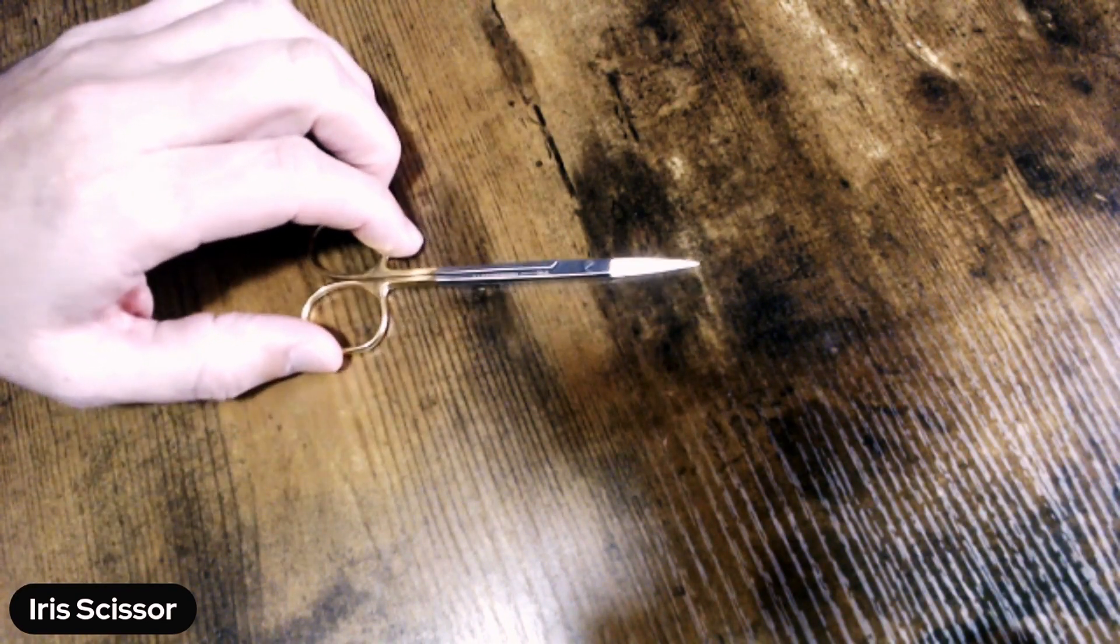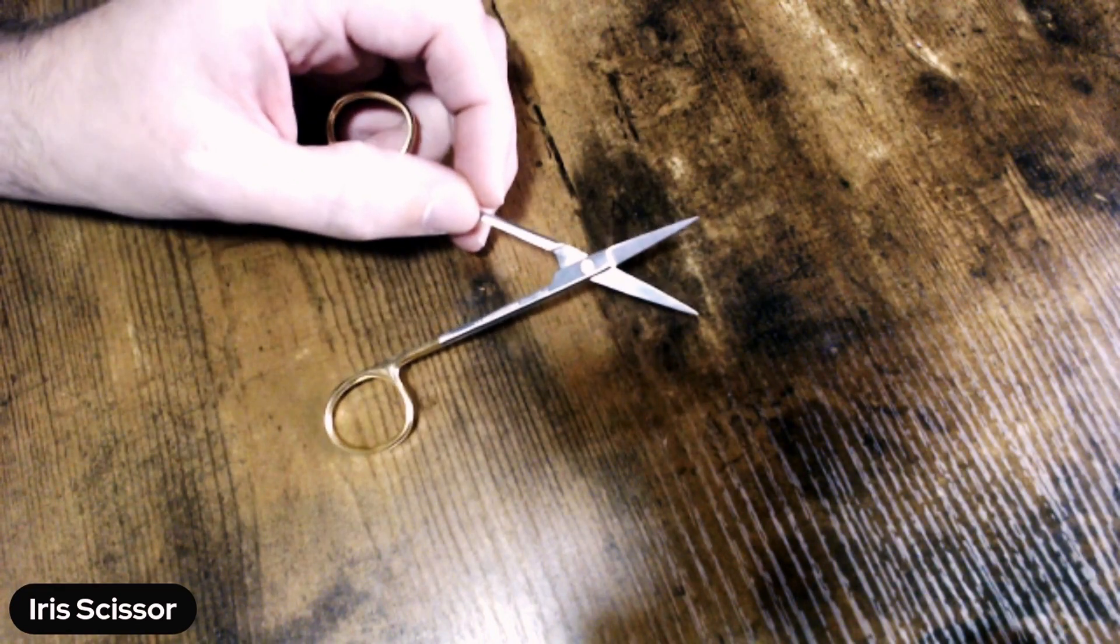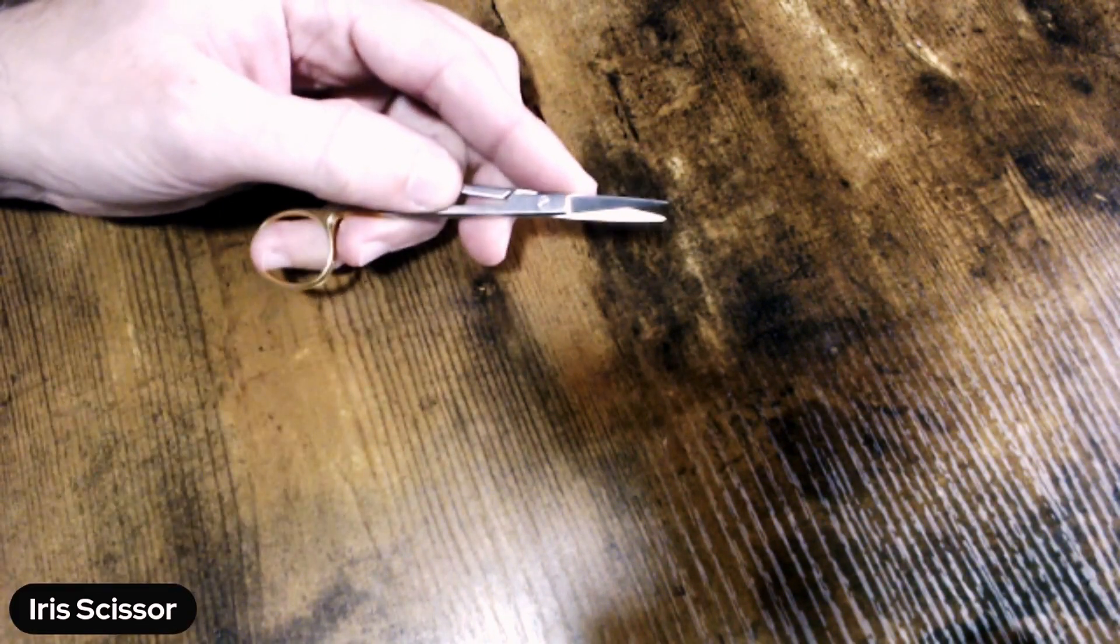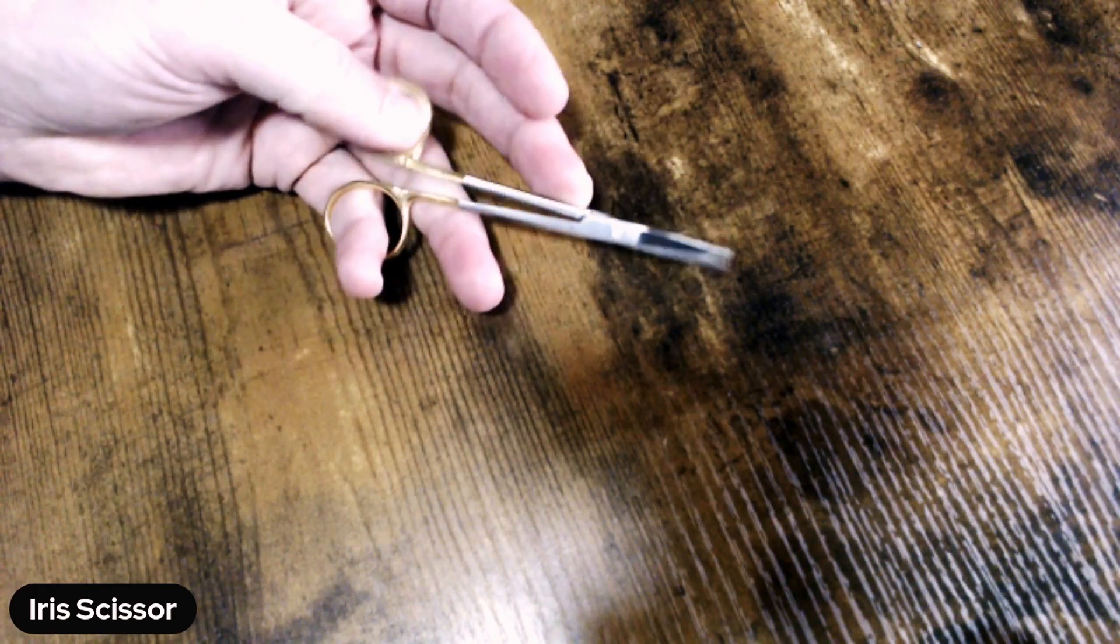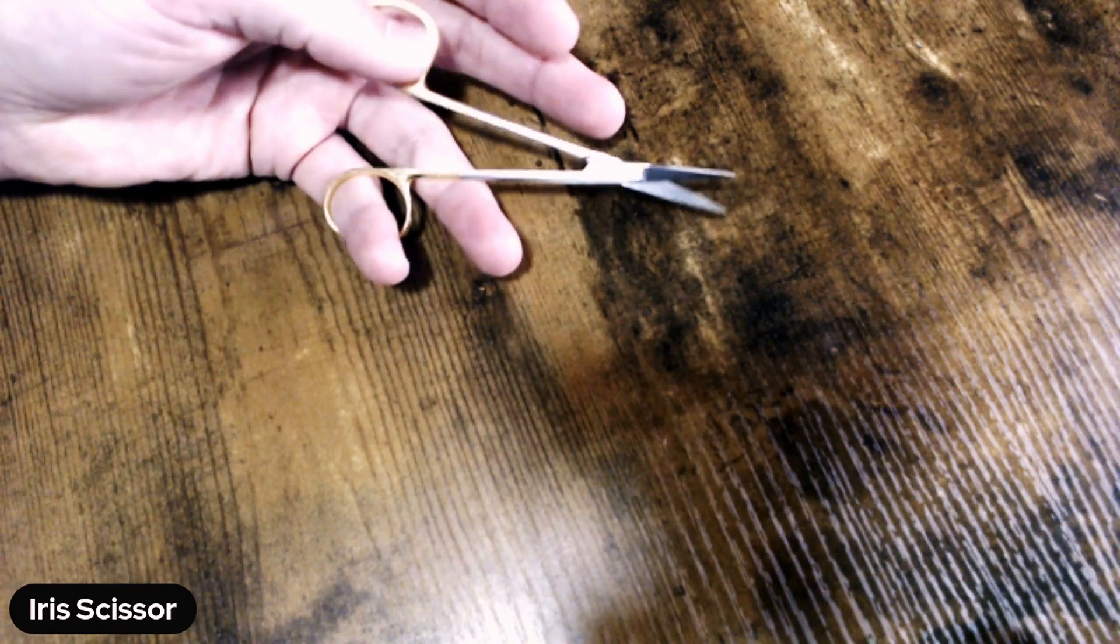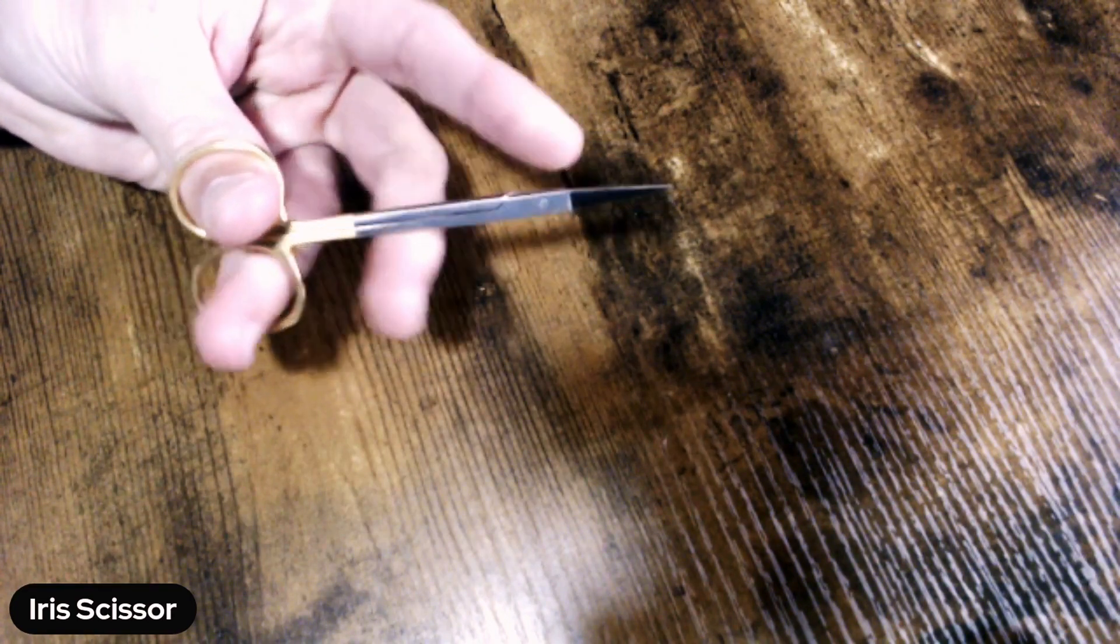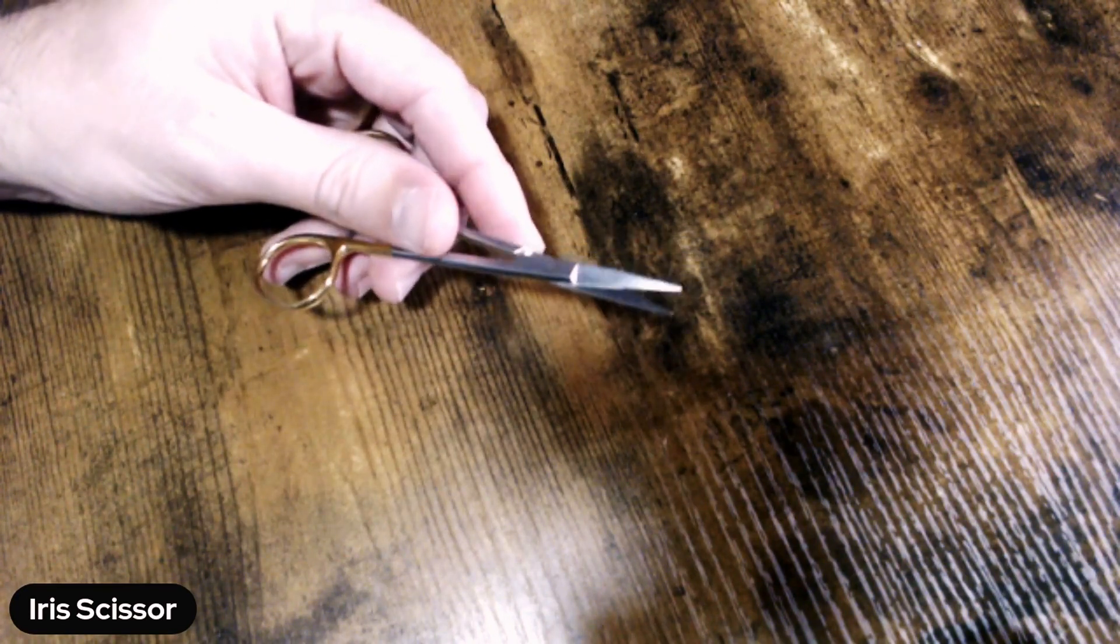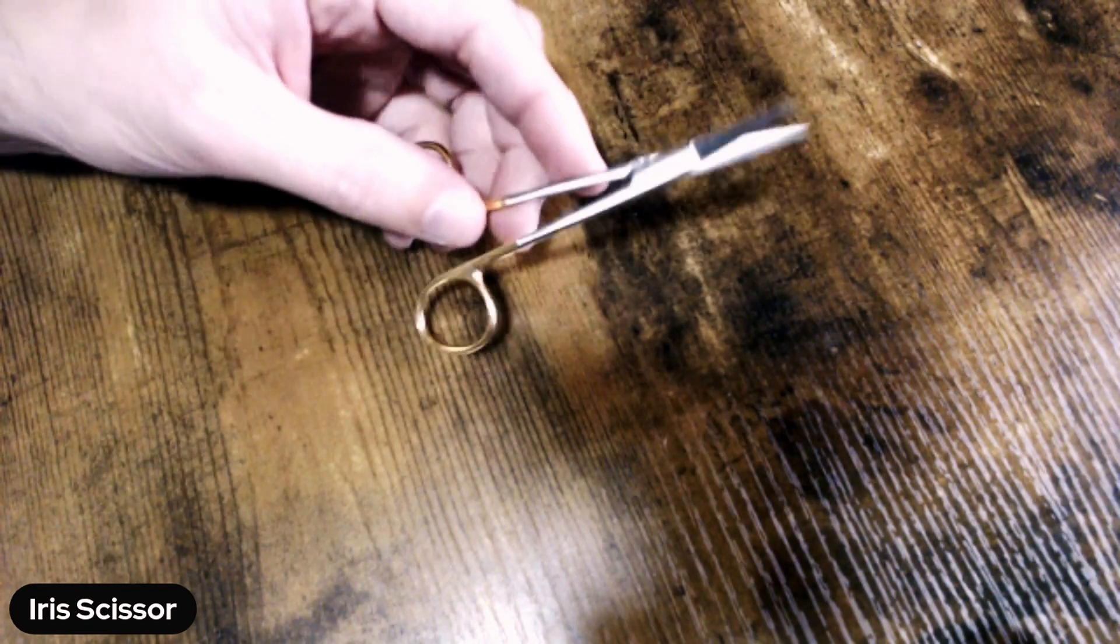And as you're handling these instruments during the inspection stage, you will grow to kind of know a feel for how smooth that cut should be. And even sometimes if you can't see the damage on the blade, oftentimes you can feel the damage as you're working that scissor up and down. Now in addition to visualizing that inspection of the sharpness, obviously you're going to want to look on the blade for any pitting or damage.